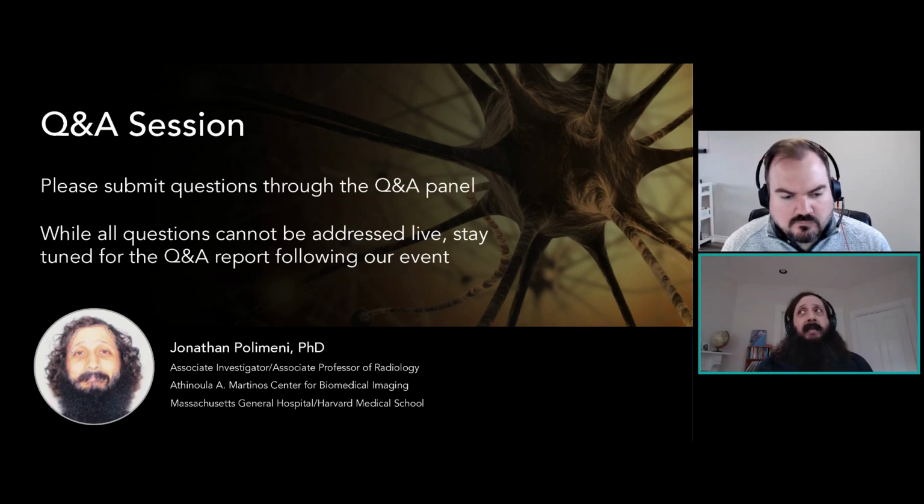And so what I'd say is that I don't think we've come across any cases where the disease would preclude the use of fMRI, but we do have to be mindful of how the disease affects the hemodynamics, and build that into our interpretation. And like I said, these techniques like CVR are becoming much more routine in order to do so.